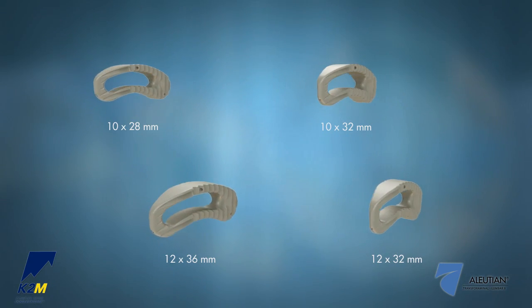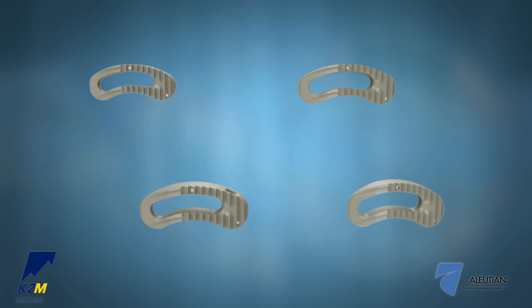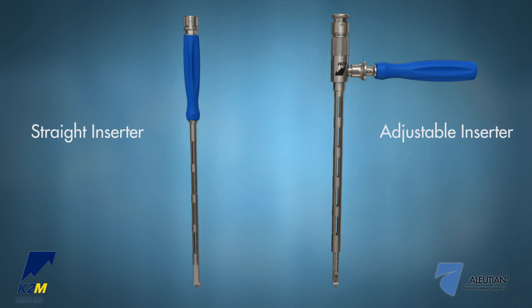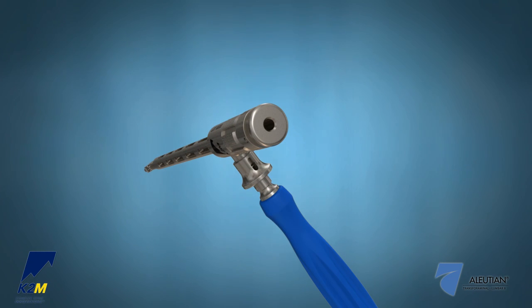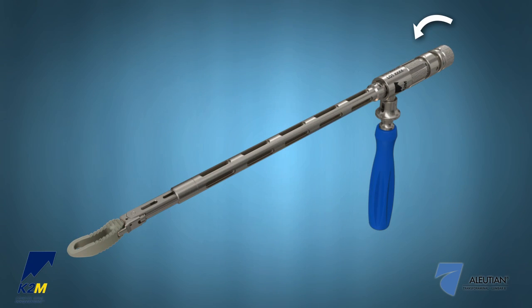ALEUTIAN TLIF 2 implants are available in 4 footprints with heights ranging from 7 to 15 millimeters in 1 millimeter increments. There are 2 inserter options for placing the implant: a straight inserter and an adjustable inserter, which allows for varying implant angulations. If the adjustable inserter is used, insert the adjustable inserter inner shaft through the proximal end of the inserter. Attach the implant to the threaded stud at the distal end and tighten the implant to the inserter by turning the knob of the inner shaft at the proximal end clockwise.